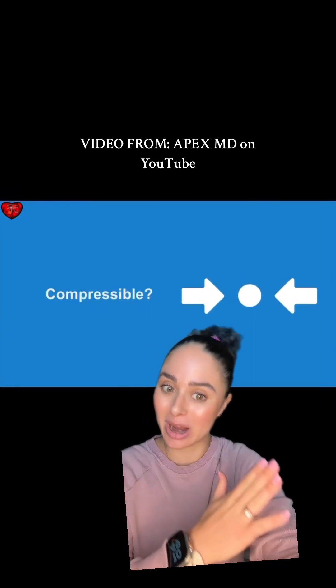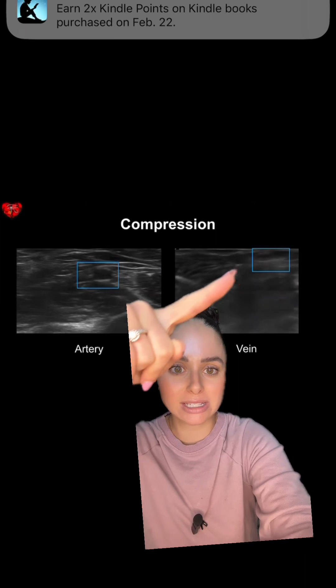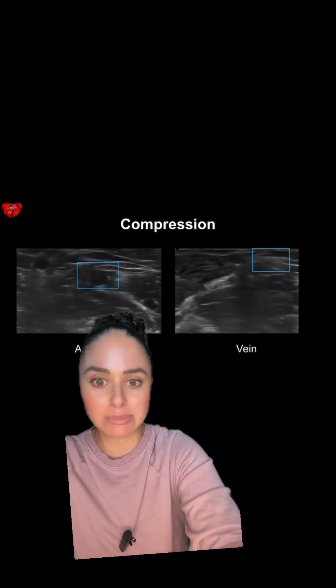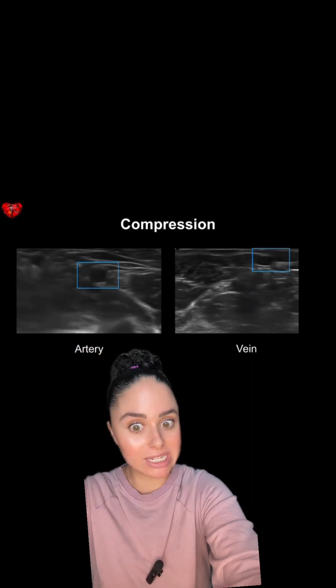This is another great thing to compare: veins versus arteries, to make sure you're not poking an artery. If you compress the vein down it should collapse. Arteries are not going to collapse — you're actually going to see a little winking motion because they're pulsatile.